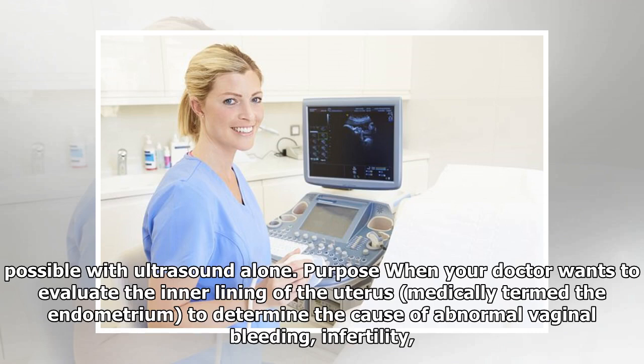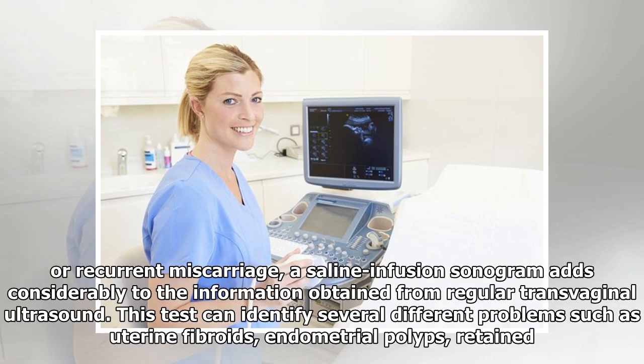When your doctor wants to evaluate the inner lining of the uterus, medically termed the endometrium, to determine the cause of abnormal vaginal bleeding, infertility, or recurrent miscarriage, a saline infusion sonogram adds considerably to the information obtained from regular transvaginal ultrasound.